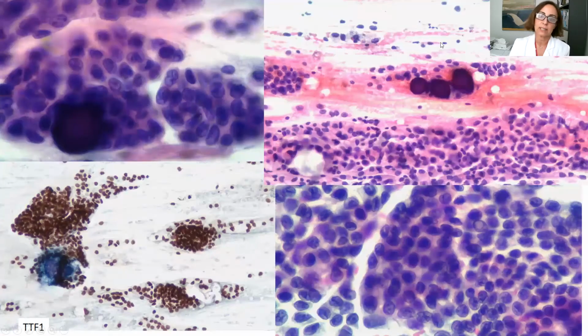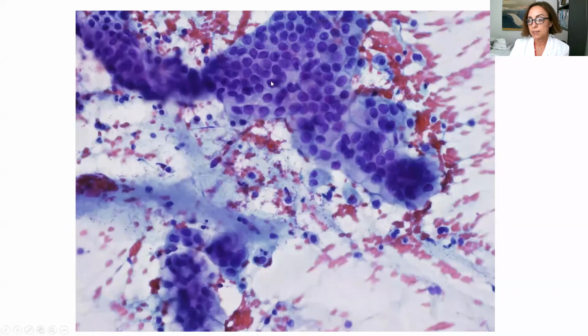And this is another example of a lung tumor with psammoma bodies, a lot of psammoma bodies, and irregularities of the nuclear membrane, even with groups like thyroid papillary carcinoma, and even with intranuclear inclusions like thyroid papillary carcinoma. In this case TTF1 is positive, and the patient has a lung mass with mediastinal lymph node metastasis. With this smear, there is no problem saying that this is a mucus-producing adenocarcinoma.